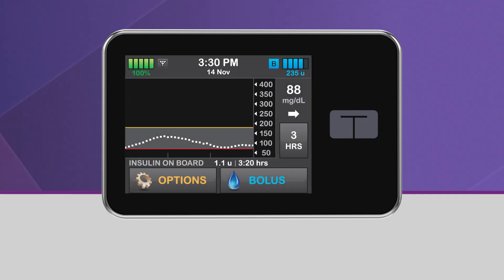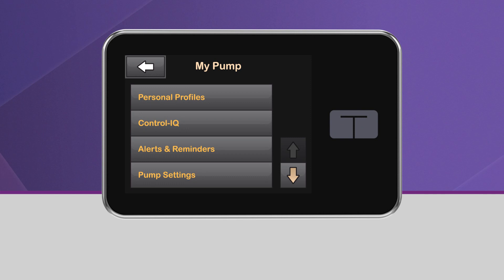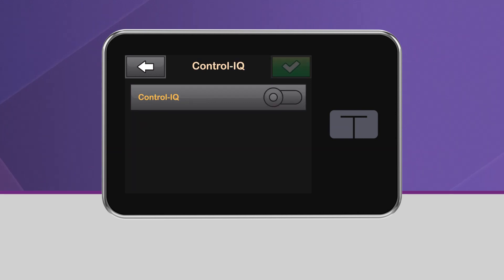To turn on Control IQ Technology, from the home screen, tap Options, then tap My Pump. In the My Pump menu, tap Control IQ. From this screen, turn Control IQ on by tapping the toggle next to the Control IQ text.